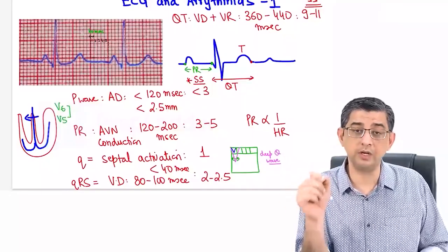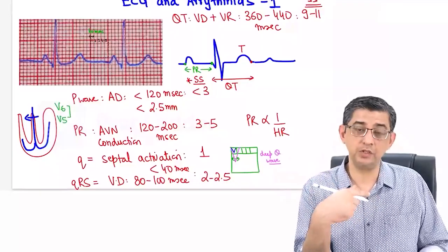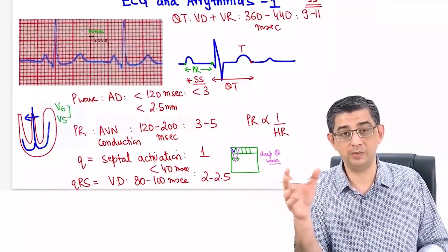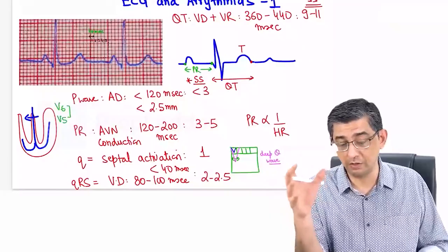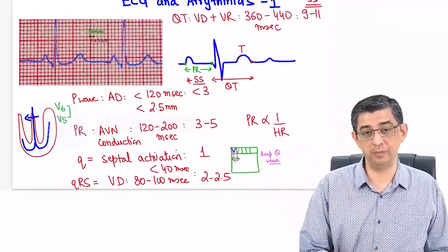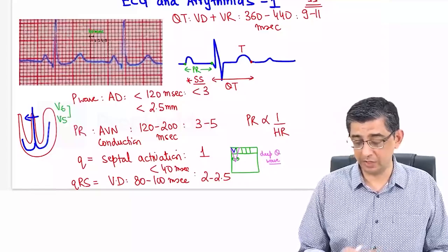So a lot of questions on electrolyte imbalance will come, and that is the reason why, even in the lecture series, you would have seen I've taken a separate lecture on ECG findings in electrolyte imbalance, because that itself is a topic which has a lot of questions that are going to come. At the moment we're focusing on some baseline information. I basically want you at the moment to remember that these durations are important.